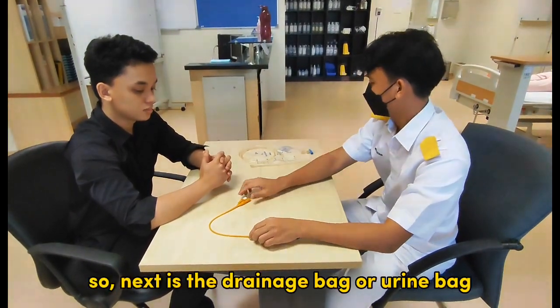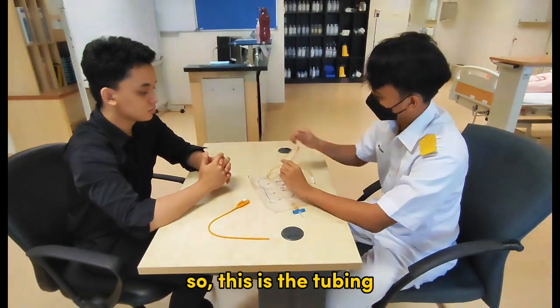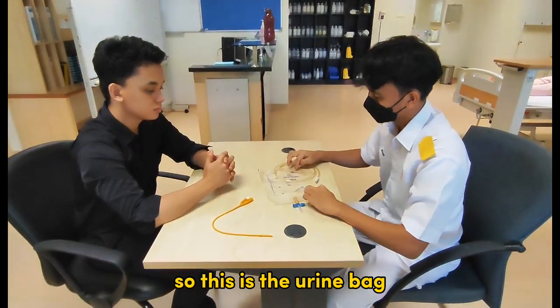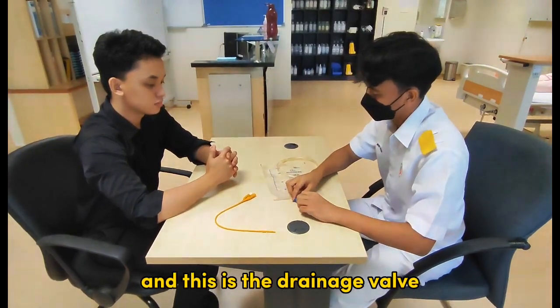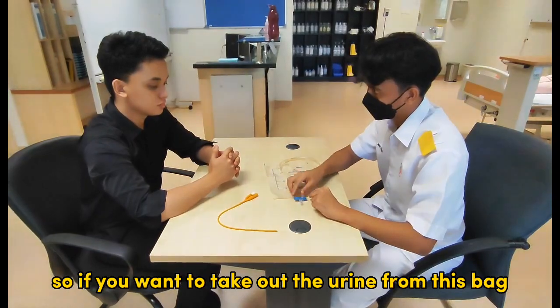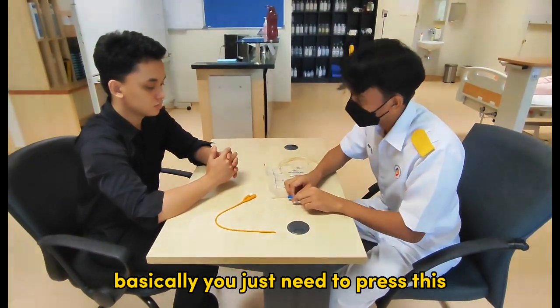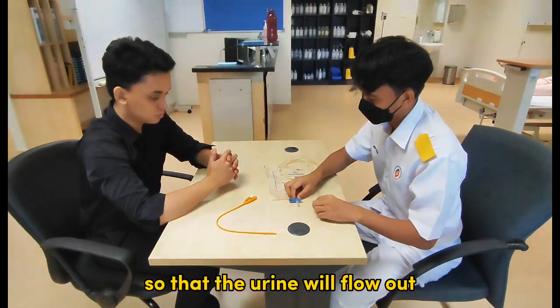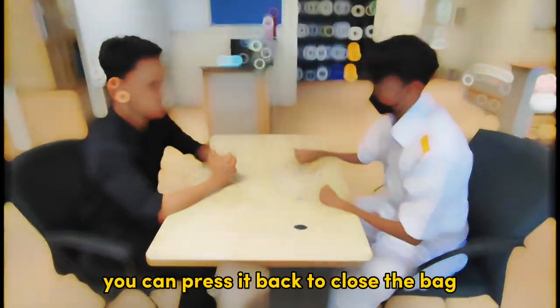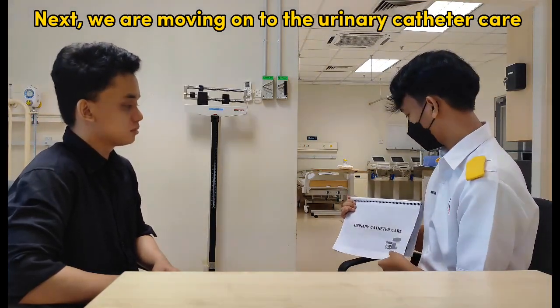So next is the drainage bag or urine bag. This is the tubing. This is the urine bag, and this is the drainage valve. If you want to take out the urine from this bag, you just need to press this so that the urine will flow out. After you finish, you can press it back to close the bag. Next, we are moving on to the urinary catheter care.